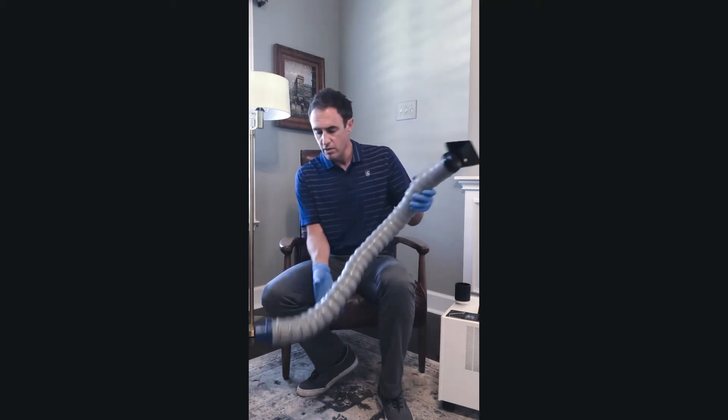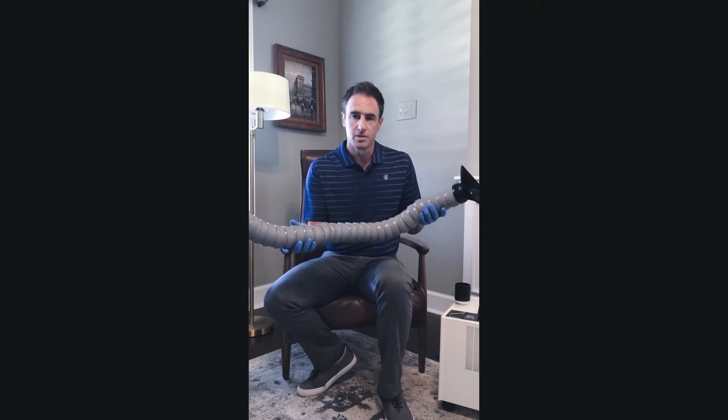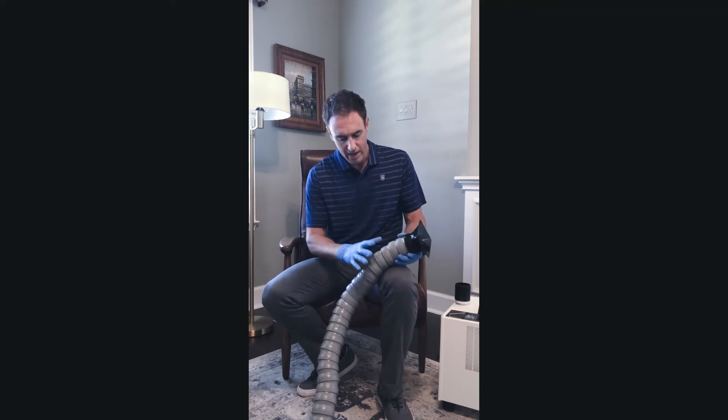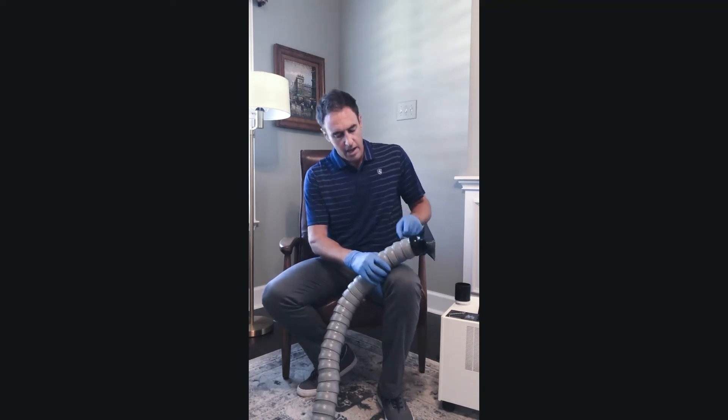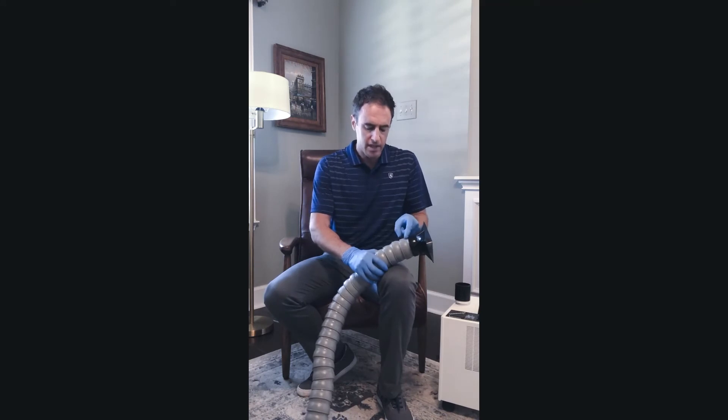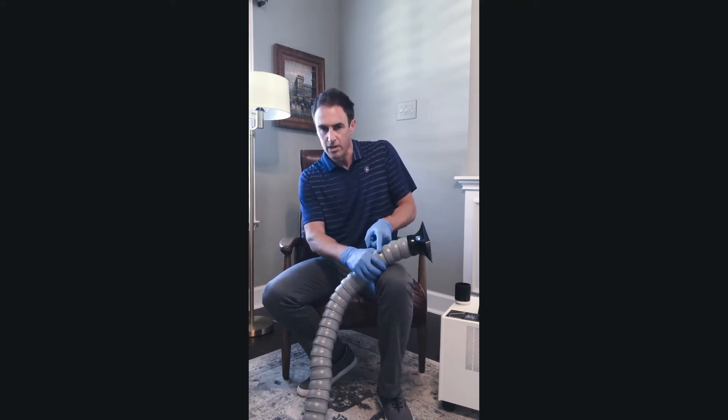What you want to do is remove the whole hose assembly from the unit and find a place to sit down. Once you've done that, you're going to put it right next to your leg like this. You're actually not going to remove the rectangular capture mouth from the hose links — you're going to remove the links right about here.